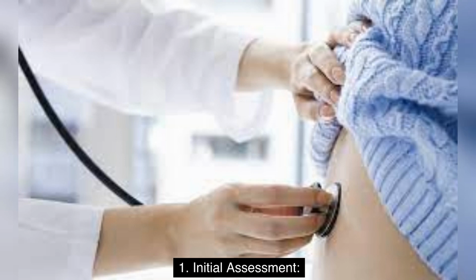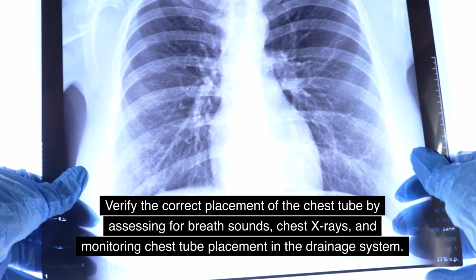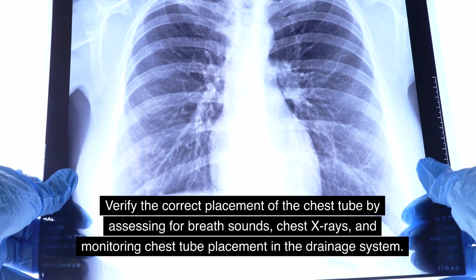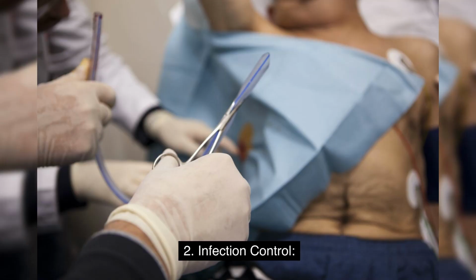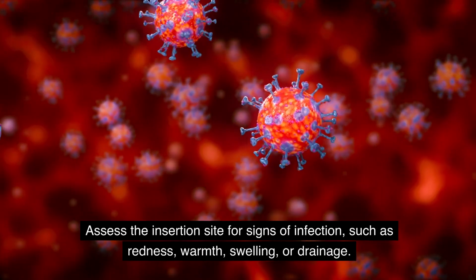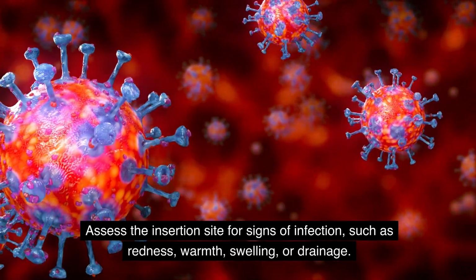1. Initial assessment. Perform a comprehensive assessment of the patient before chest tube insertion, including respiratory status, vital signs, and chest examination. Verify the correct placement of the chest tube by assessing for breath sounds, chest X-rays, and monitoring chest tube placement in the drainage system. 2. Infection control. Maintain strict aseptic technique during chest tube insertion and dressing changes to prevent infection. Assess the insertion site for signs of infection, such as redness, warmth, swelling, or drainage.